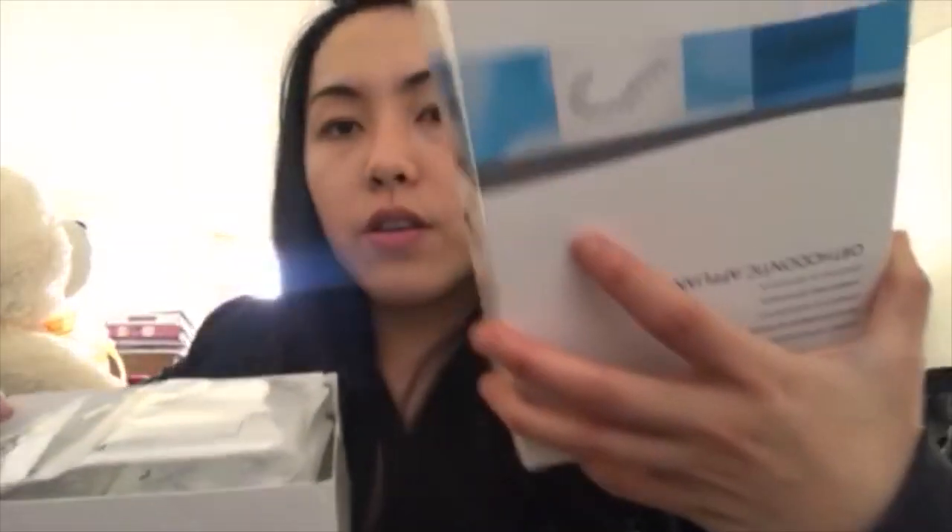I'll tell you everything I got from the office today. I got a package of trays that includes the chewies, the rubber bands, and the trays. There's also another box with a manual, and the tray box comes with two.